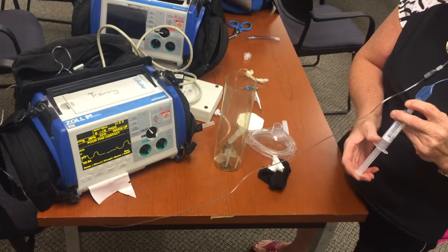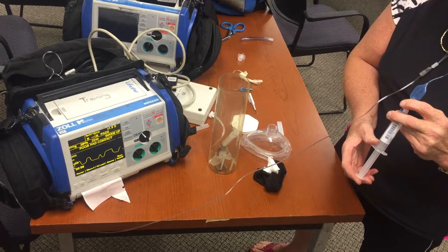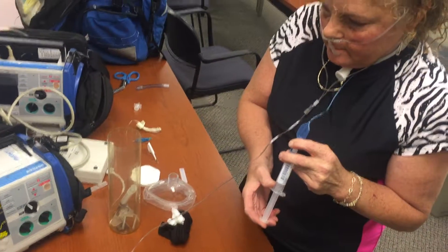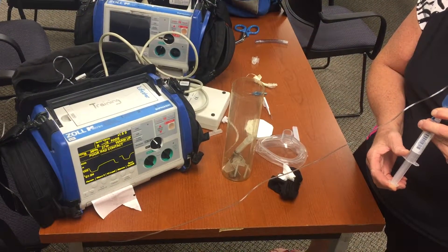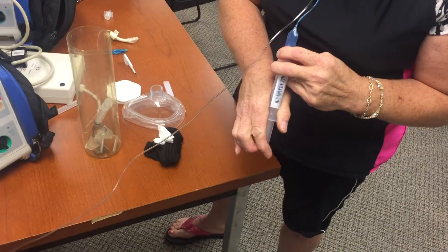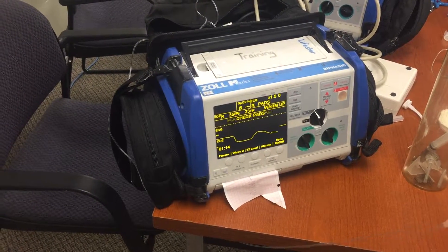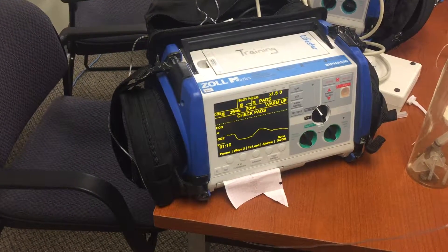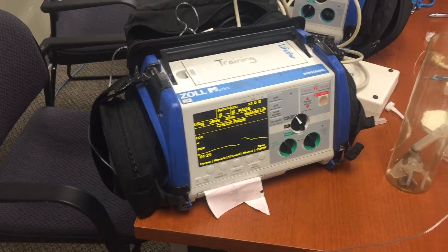Alright, so we got a capnography waveform here. If you want to make sure that our cuff is inflated fully, she's going to inflate the cuff on her trach and we should see that end-tidal slowly disappear. There we go — we got no more waveform, our cuff is inflated.